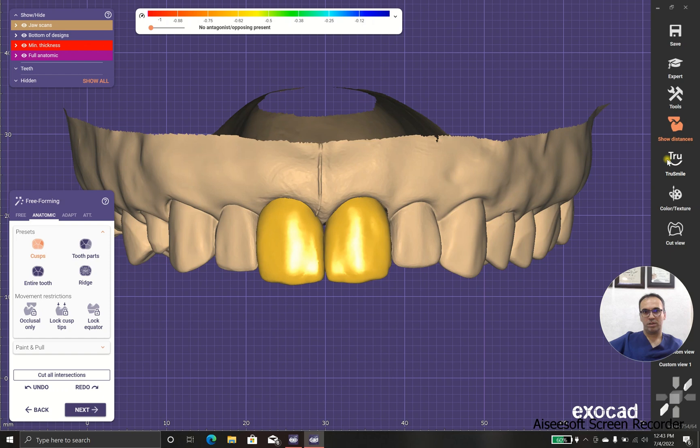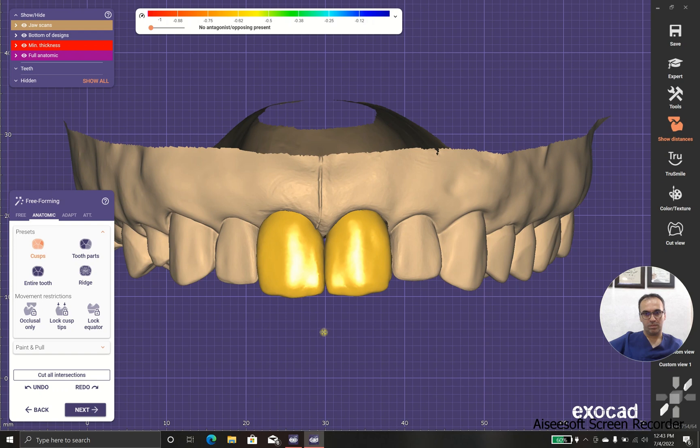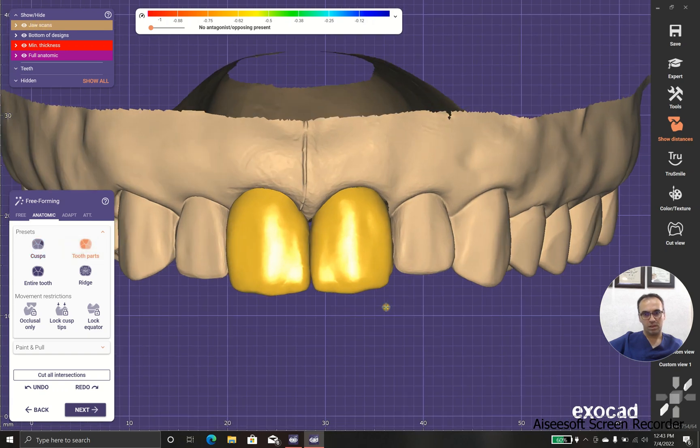And what else do we have here? As you can see, this piece and this piece is not the same.